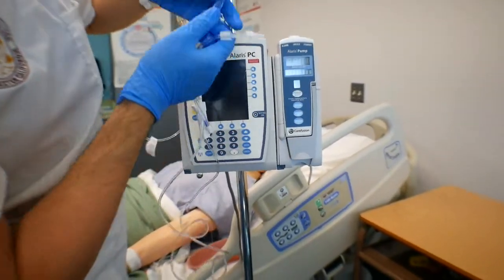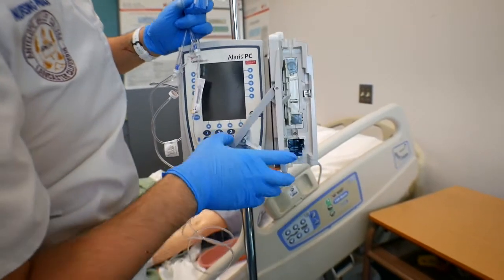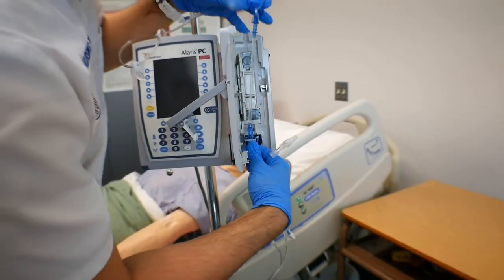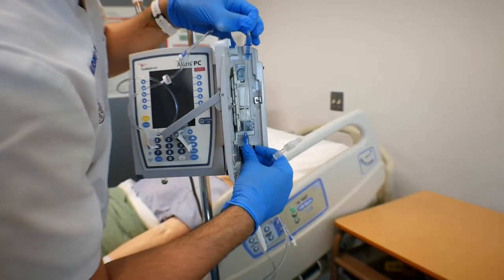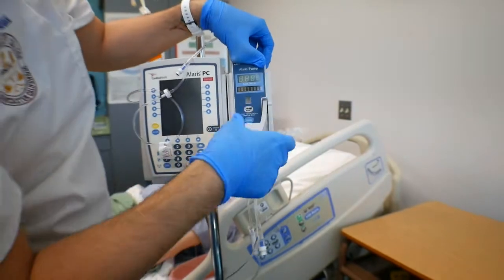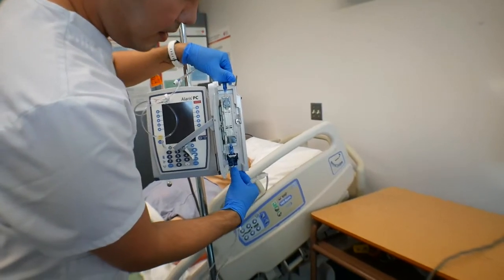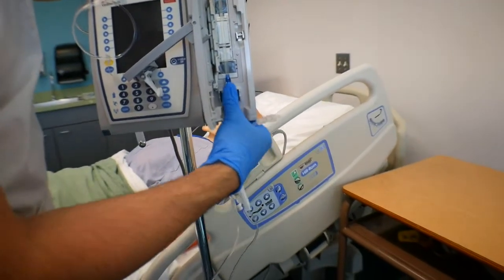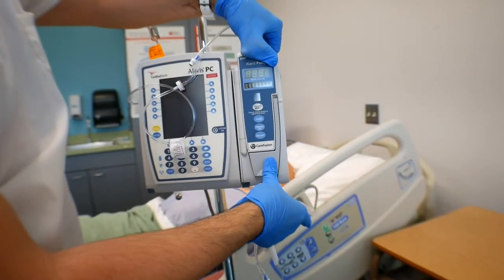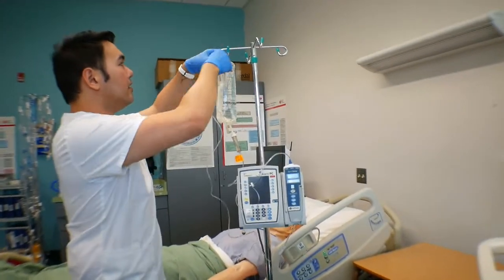So you're going to open the channel. From here, you just pull it and it should pop out easily. And then this is gonna go here. And this is gonna go here. There we go. So you see that when you close it, just make sure the space is actually filled. And as you close it, just push it down. Okay. So we're gonna set this aside.